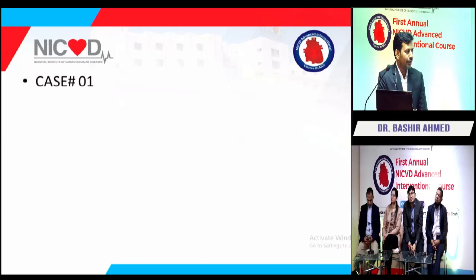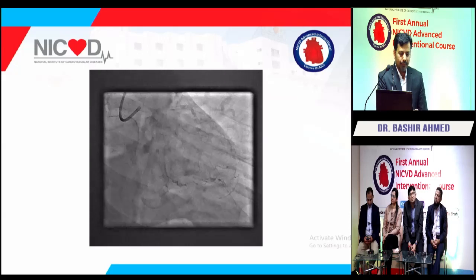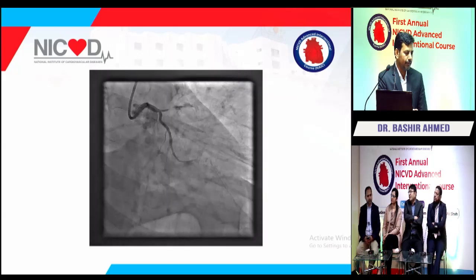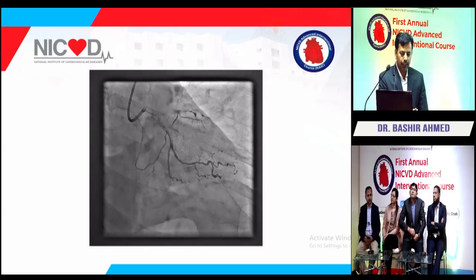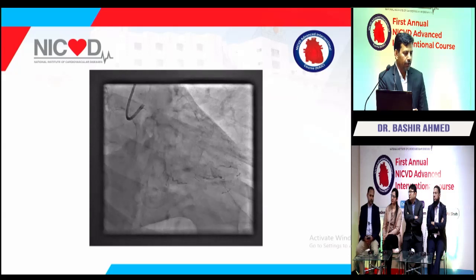After showing the two views of this case, I will discuss with our worthy panelist, Dr. Romana, who is here. I will discuss first with this young interventional cardiologist about the approach to this patient. This is the first view of this patient. As I mentioned, having failed or suboptimal prior PCI, and now again the patient presents with typical symptoms. No stent was done previously, only balloon PTCA was tried, and this is the other view.